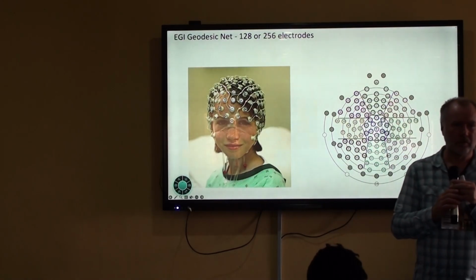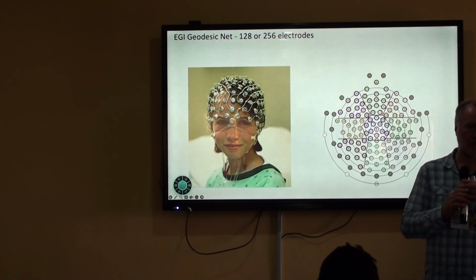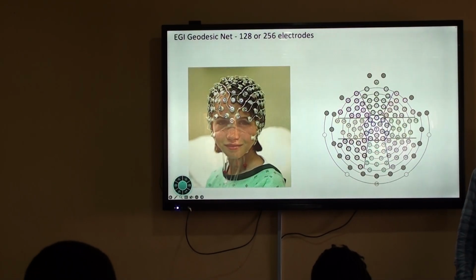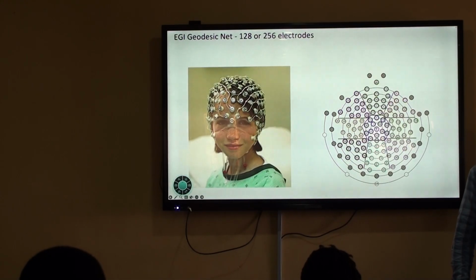It's good inside, this is 128, 256. What are the chances of having artifacts when recording? Because it looks more sensitive. And the other is, in my practical area, we try to use tape like in the ICU, where artifacts are so high. What is your point?